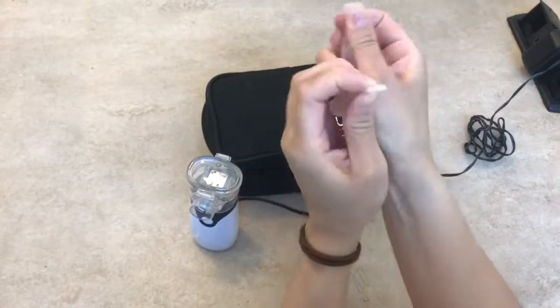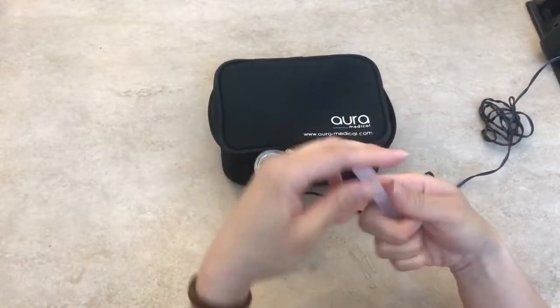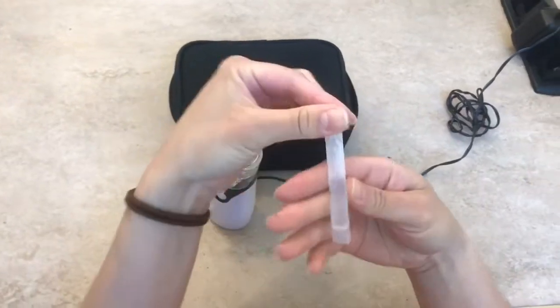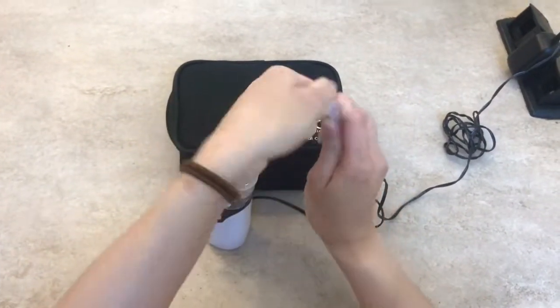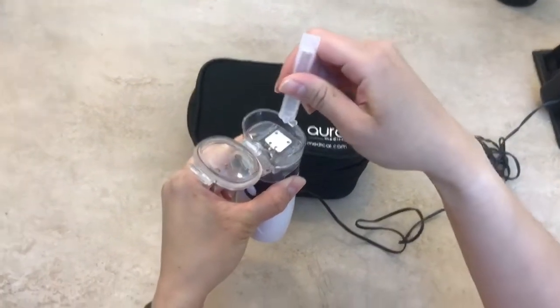This is Duoneb right here. Twist off the top, and then you simply pour it in there.